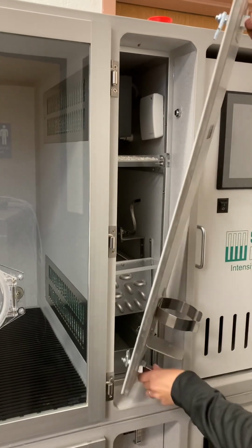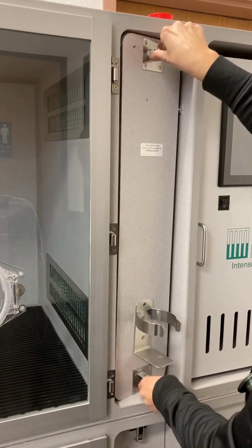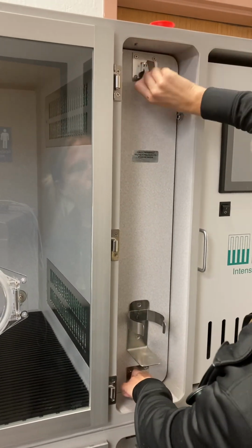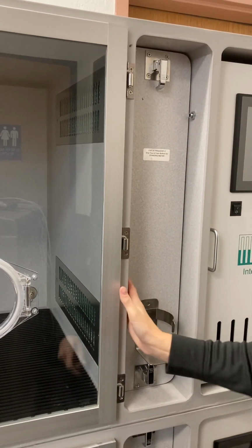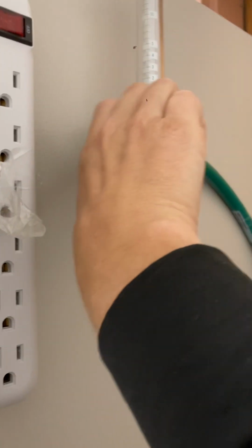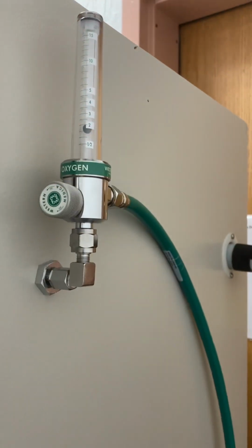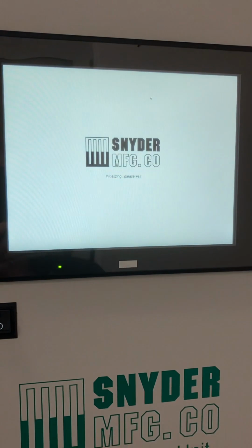So go ahead and put your door back on. Same thing, slides in sideways maybe. And then these just twist and lock. And then put your little red cap back in. And then next thing you're gonna do is turn on your flow meter here. So you wanna have it wide open, but it's only gonna show 2 liters a minute, totally normal. Go ahead and turn on the Snyder using the button below the touch screen. It'll start up.